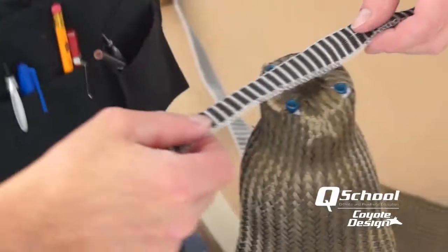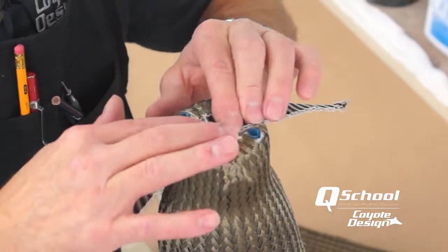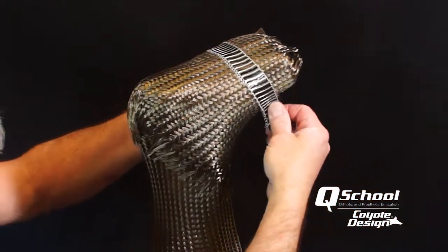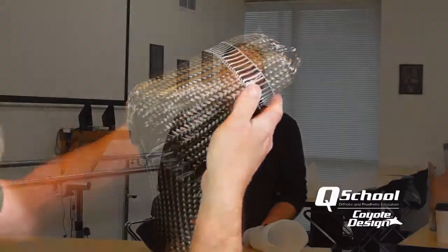For us it's been an easy switch, and our technicians would never want to switch back — we really don't miss carbon fiber at all. We still use carbon tape to reinforce the distal ends and any area where we want a lot of strength, but we always keep that inside the trim lines so we don't get that irritation. Carbon tape is also relatively inexpensive compared to the braid we used for all our laminations, so it's been a big money saver, irritation saver, and a benefit to the patients themselves.